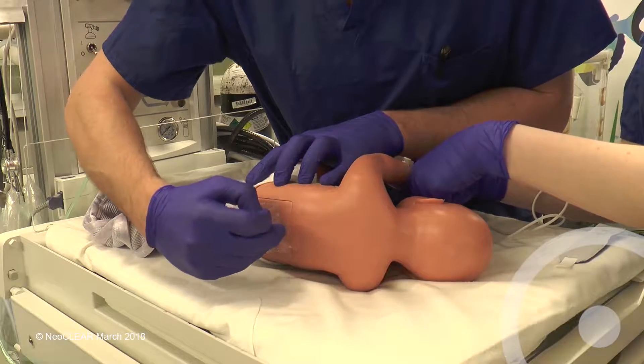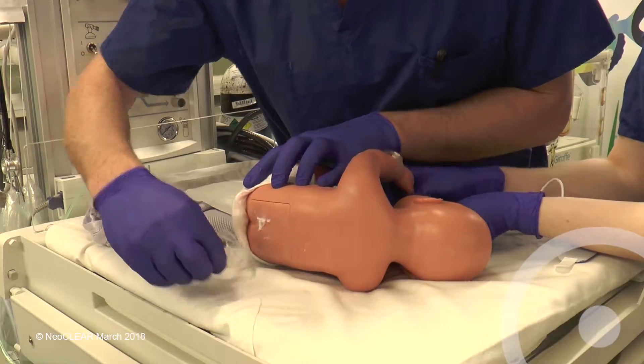Attach the SATS monitor to the right hand and ensure that the trace is adequate.